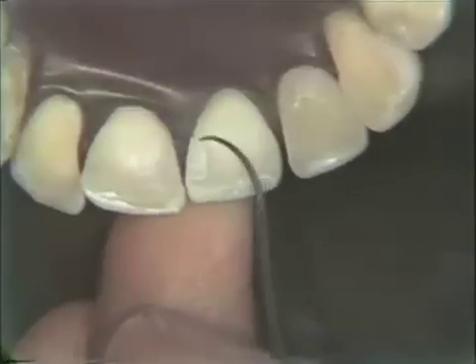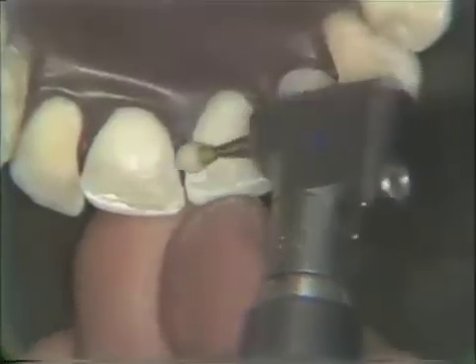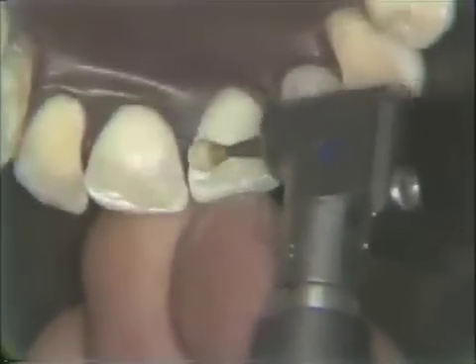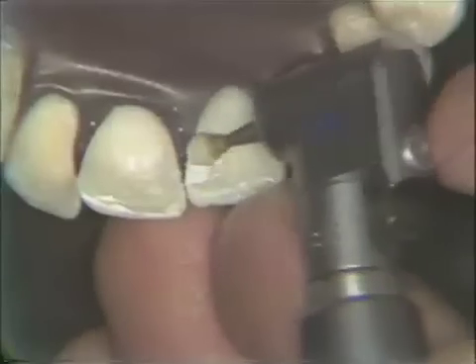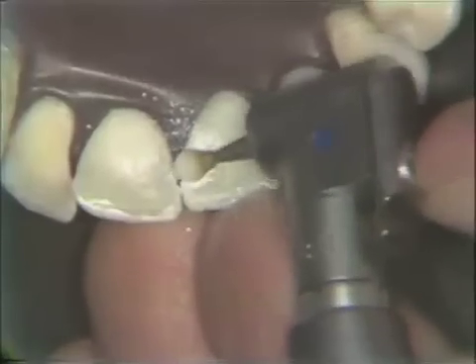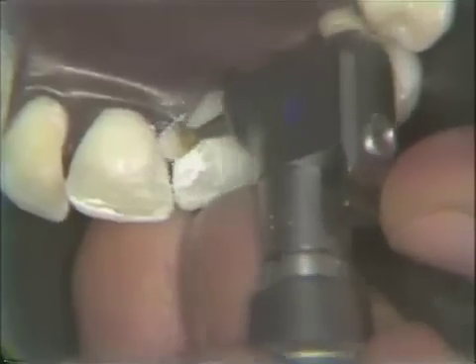Now we check. We notice there's a little heaviness here and there. The white Arkansas point now is brought into play. And we will go over any area that has been touched, which in this case has been the entire lingual portion of the preparation. Anything that has been touched by the green stone must now be touched by the white stone, or it will leave a roughness. Roughness, of course, will not be comfortable to the patient, and it will also have a tendency to collect plaque and have recurrent caries more readily.